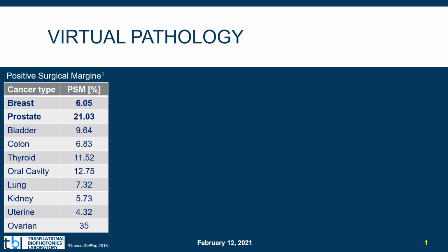We can ask ourselves why virtual pathology is important. One of the possible answers is in rapid diagnostics of positive surgical margins. In the US, positive surgical margins occur in a range of 4.32% up to 35% of surgical resection cases. The appearance of positive surgical margins leads to further oncology treatment or even to new surgeries, which will influence patient outcome and health cost. Currently, positive surgical margins are diagnosed using post-operative formalin-fixed paraffin-embedded histology.